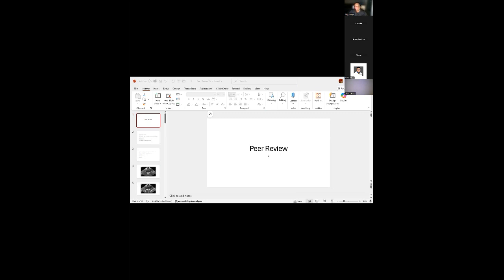So we did a day 2 scan, and I did that with a linear probe. That's one of my first scans, so excuse the quality. What I thought at that time is that there is definitely a flare or bleed here, and there is midline shift.